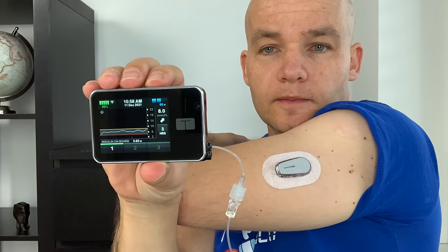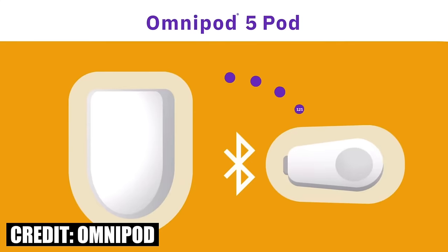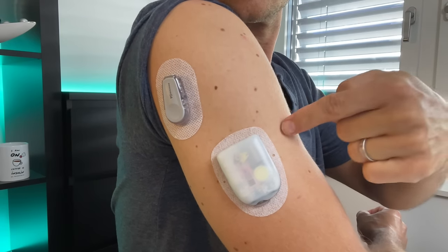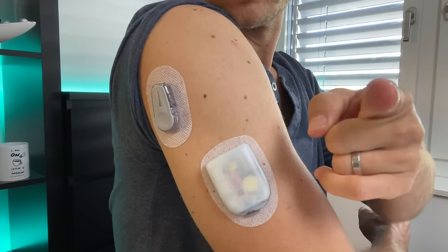Another consideration when picking your infusion site is your CGM sensor. For the algorithm to work well you need constant data transfer from the sensor to the pump, but the Bluetooth signal doesn't travel well through the human body, so it's important to have the sensor and pump in line of sight. With Omnipod 5 you need to think about this proactively whenever applying a new pod or sensor — once the pod is applied in a bad position relative to your Dexcom, there's nothing you can do except remove it and apply a new one, wasting the pod. With the Tandem pump it's easier because you can move it from one pocket to another. Both Omnipod and T-Slim X2 currently work with Dexcom G6.